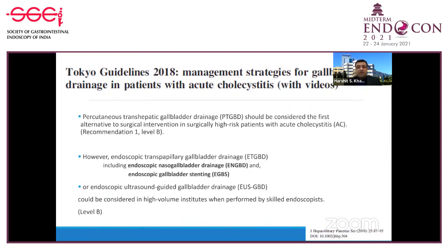And another alternative, which is now included in the Tokyo 18 guidelines, which is not part of the Tokyo 13 guidelines, is the endoscopic ultrasound guided gallbladder drainage as an alternative modality of gallbladder drainage. Now, these should be considered in high volume centers performed by skilled endoscopists requiring specialized techniques as well as specialized equipment.